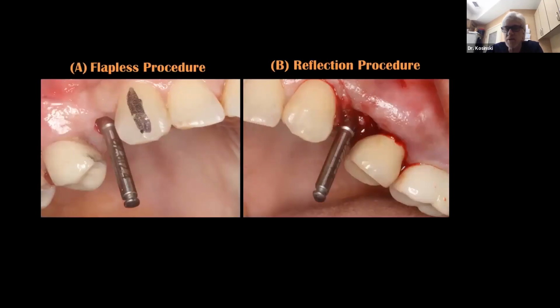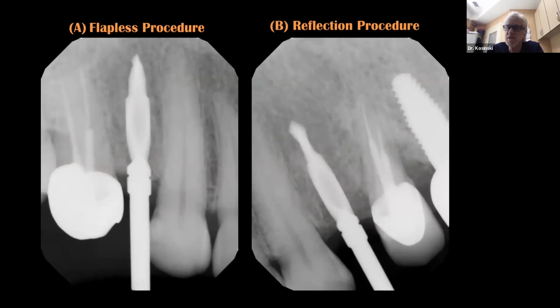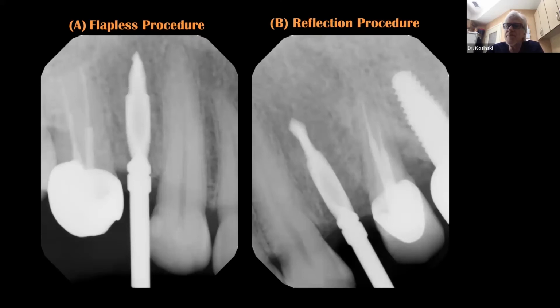And again, I will stop and take a radiograph and look at my positioning. This is the 3.0 diameter osteotomy burr. You can see the little notch, and we will determine position and angulation radiographically. Mesial distal, are my dark spaces equal? Am I thinking tooth up in this situation? Am I thinking emergence profile coming out of that edentulous ridge?